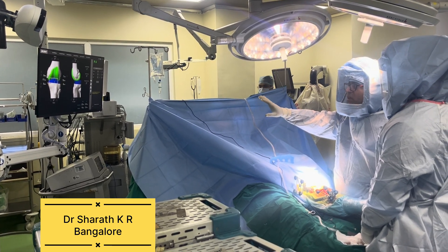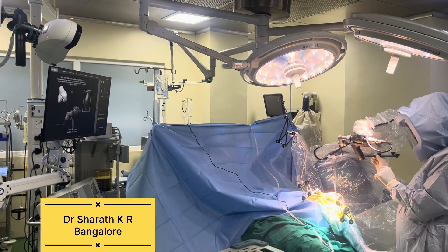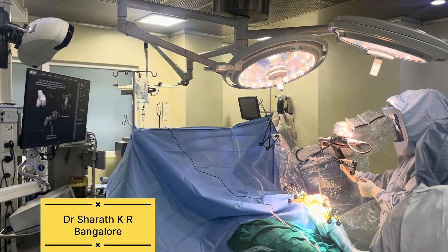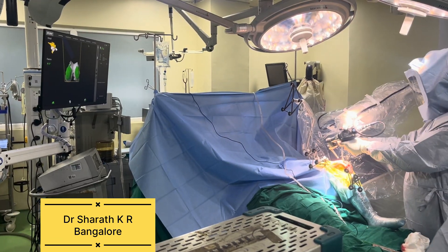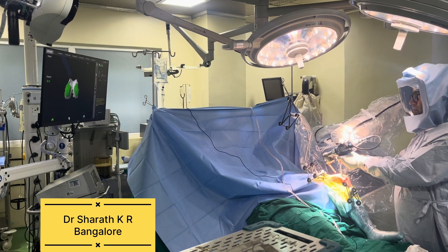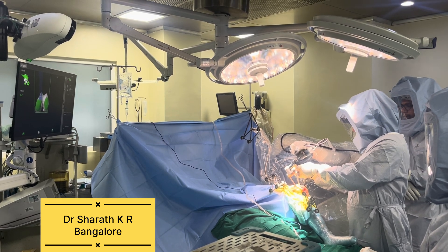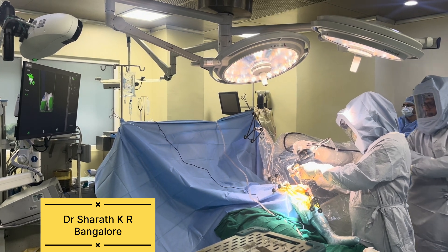In order to get this balance right, we will be doing particular changes in the bone resection. The bone resection values and angles at which we will be cutting are very clearly determined and shown on the monitor in front of us. You can see that there is a green line where we are doing the resection.